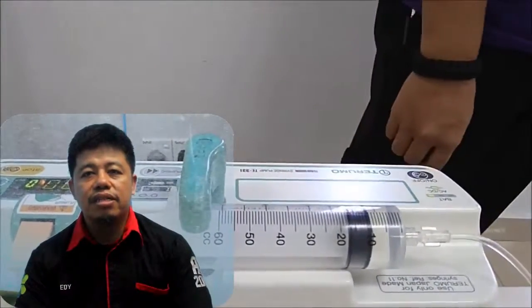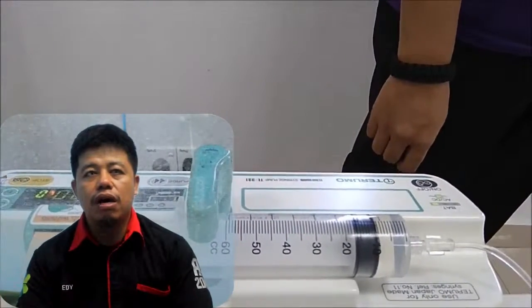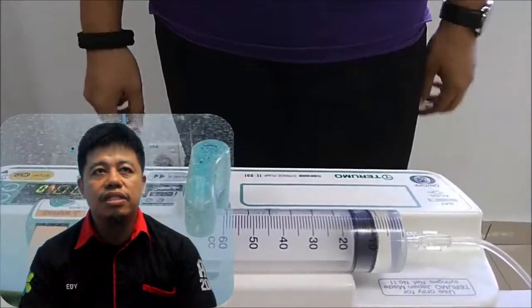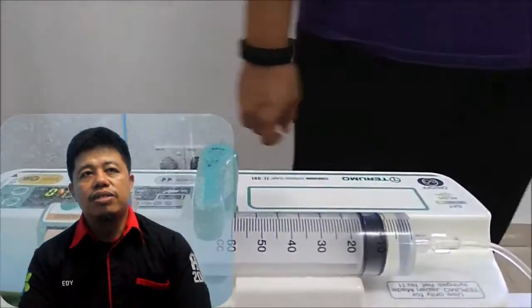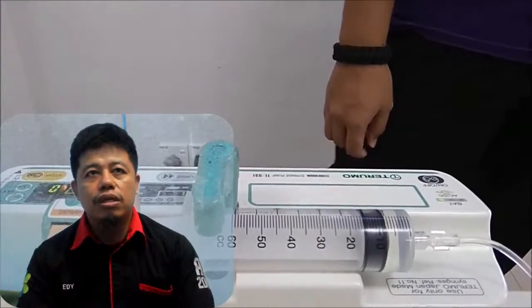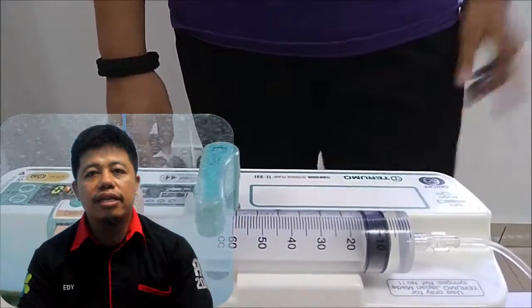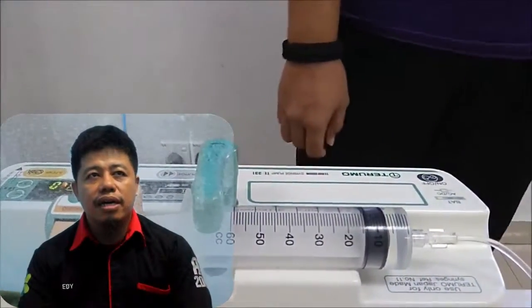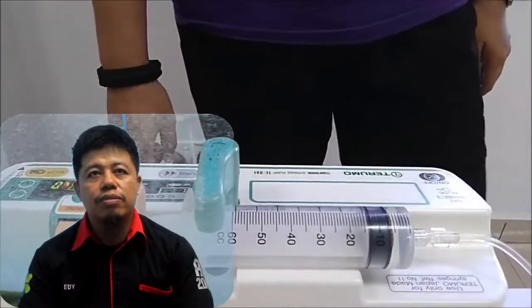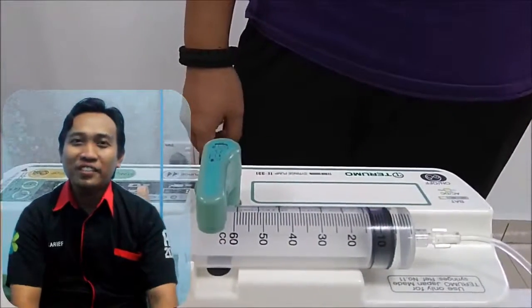Number 5, set the amount of medication to be given in cc per hour. Number 6, press start to begin administration of the medication. Number 7, if something is not right, the tool will give a warning with a sound and a red light. Number 8, evaluate the client's response to the administration of fluid.